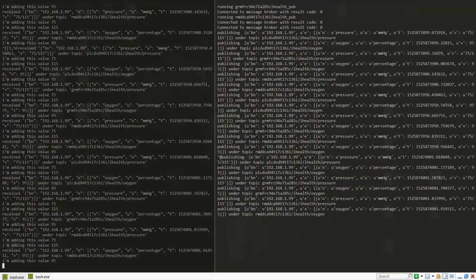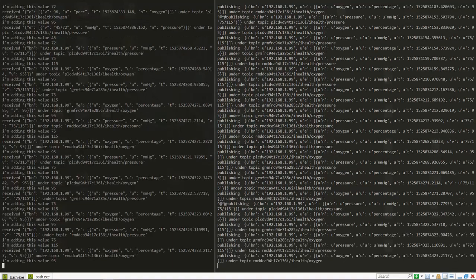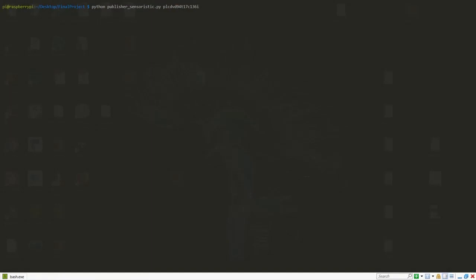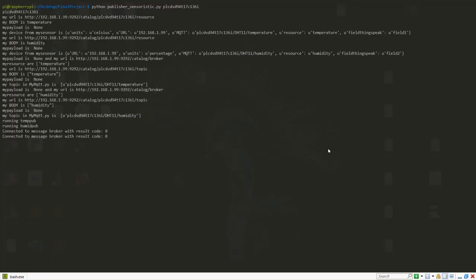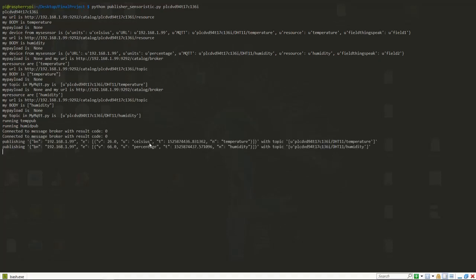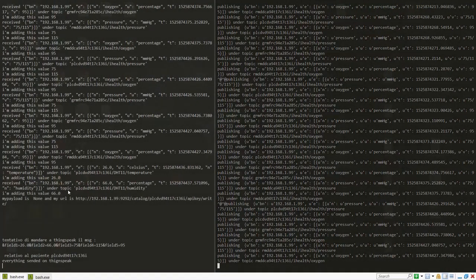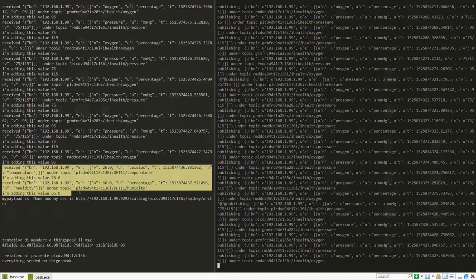will receive these resources. Now we will see how the temperature resource and humidity resource are published. We have to run the script on the Raspberry, and we will pass as a parameter the name of the patient for that resource. The client publisher is running, and every 50 seconds both resources will be published. As we can see, 2 JSON SenML related to this patient have been published for both resources, and now these resources have been received by the ThingSpeak adapter.